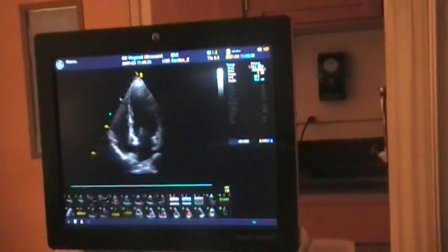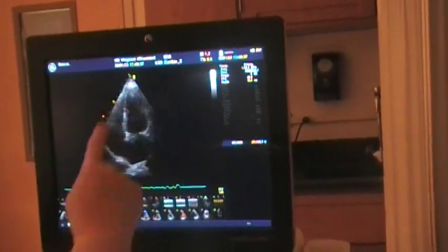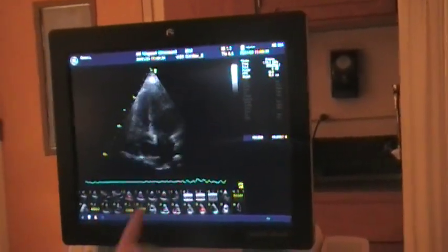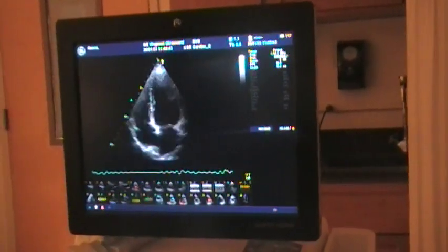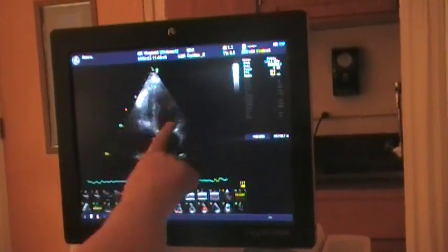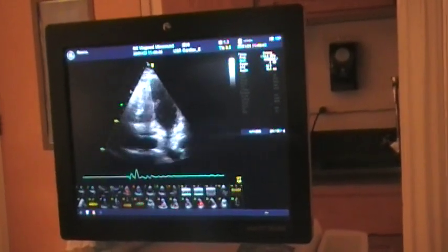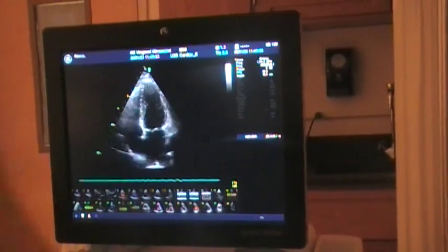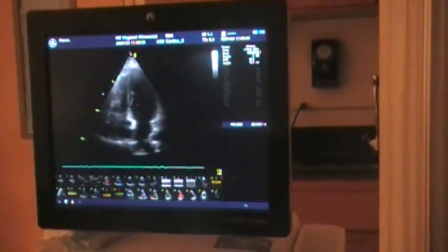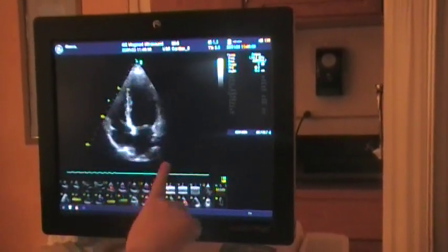You're going to have left atrium, right ventricle, left ventricle. So this is intraatrial septum, interventricular septum. You're showing that wall motion here, so you'll get just the best picture you can of it. Your walls, this is going to be inferior septum, and this is anterolateral. Pulmonary veins are coming in here.